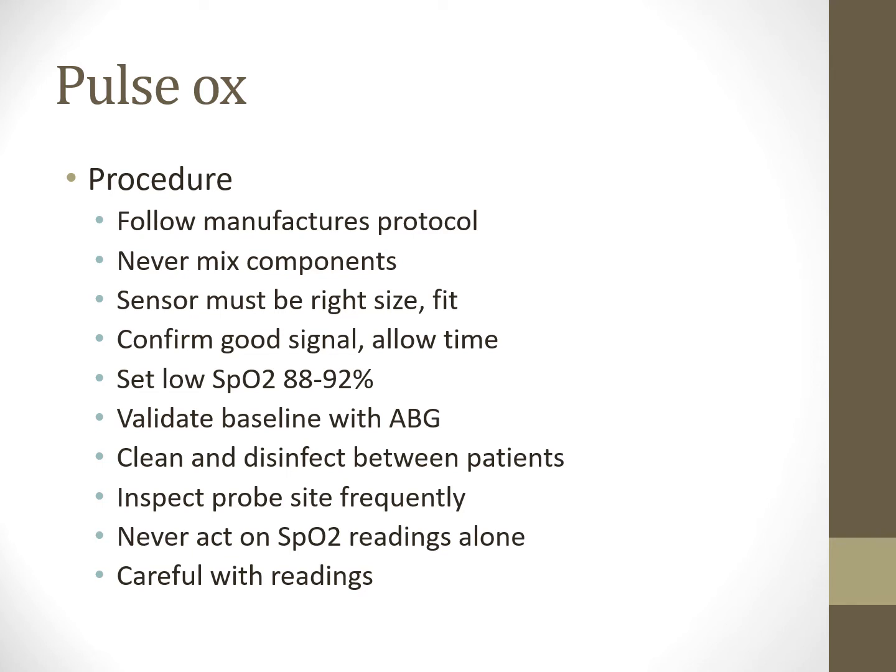So I'll put it on, and everybody's heart rate says like 50 to start off with. And then, oh, okay, now it's 83. Okay. So just give it time when you put a pulse ox on. Give it time. Don't trust that first reading. You might have to wait for the algorithm to sort of read out. So confirm a good signal.